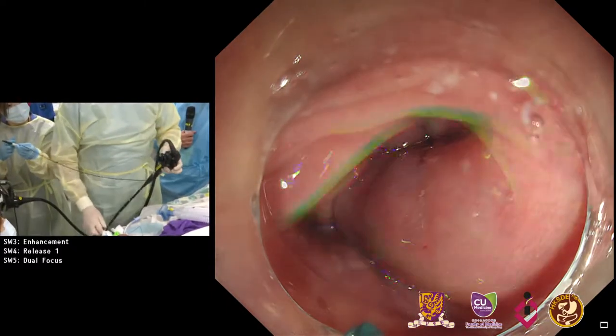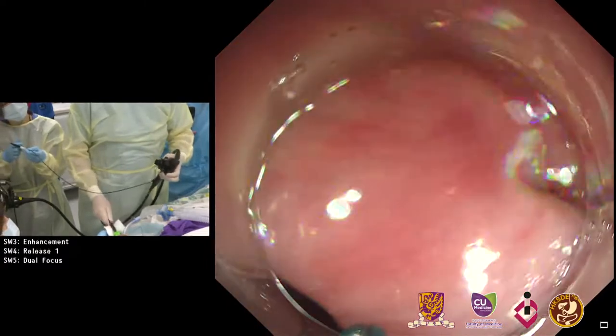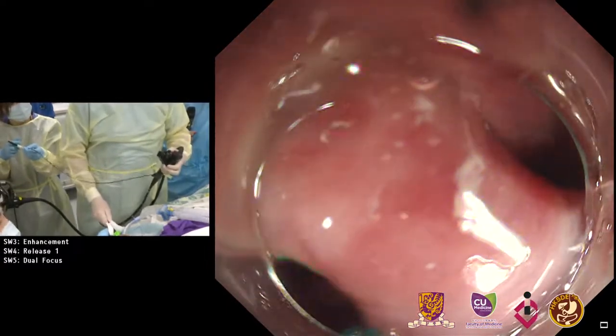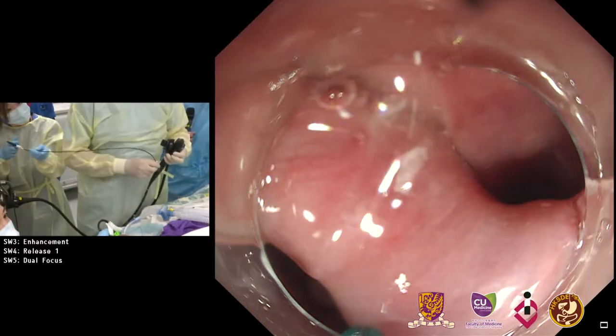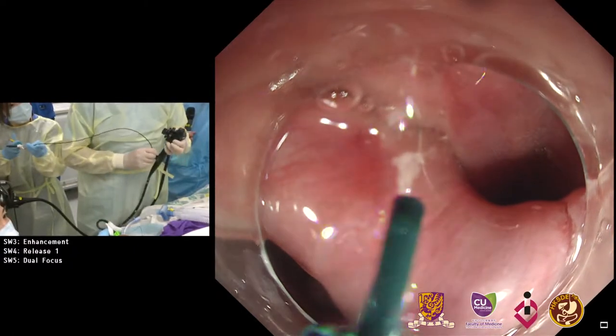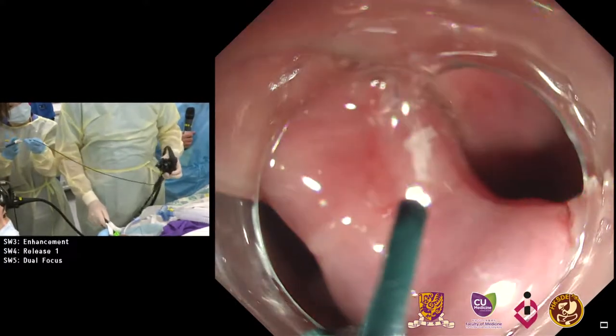I will start now on the left side of the diverticulum with the knife, going a little bit forward. The first cut is always to cut mucosa.